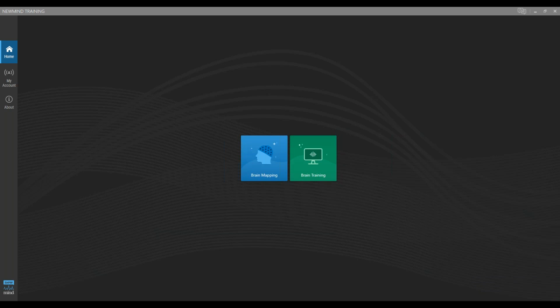So we get everybody unmuted, and I think Judy, you had a question to start with, right? We were wondering in the office about sometimes, you do all the things, you check the paste, you check the wire, you check it, and it still comes in a little crunchy on, say, one side, but yet the training efficiency is looking good. So we usually continue and go through it, but Aaron, I'd like your opinion on that and what you would do.